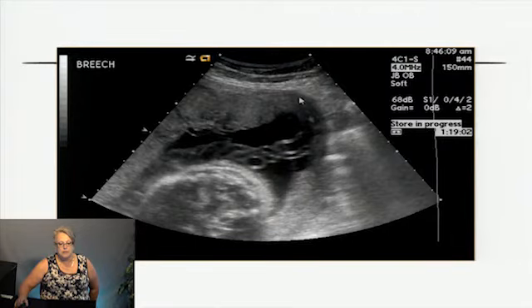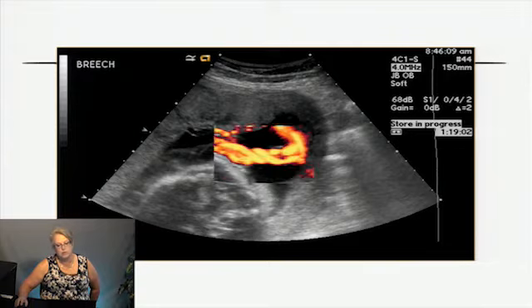So it's looking at the cross-section of the uterus. The placenta is anterior, part of the baby's head here, and I'm looking over at this left uterine wall, and it looks like cord is coming over here. So if we're seeing something in 2D and you're worried about an abnormal cord insert, what do we do? Let's put color on it.